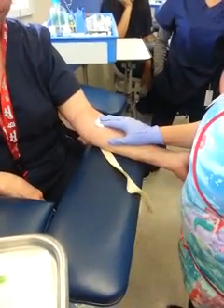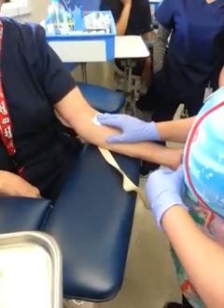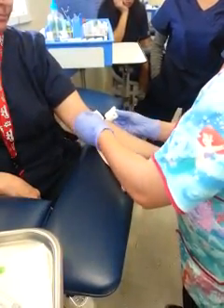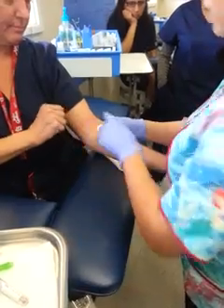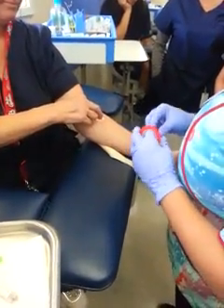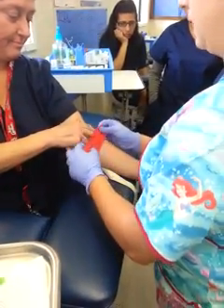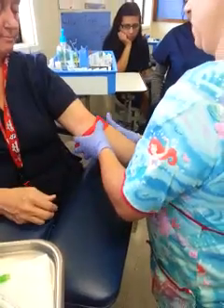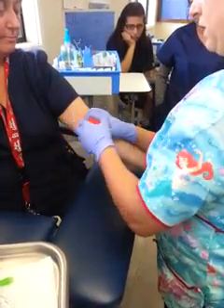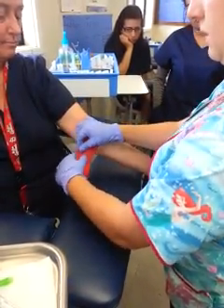Apply pressure if needed depending on how much blood you have. You can change the gauze — fold it into fours — and remove it. Ask if the patient is allergic to any tape, then go ahead and apply the coband. Wrap it nice and tight but not too tight so they can still move their arm. Twice around is perfect.